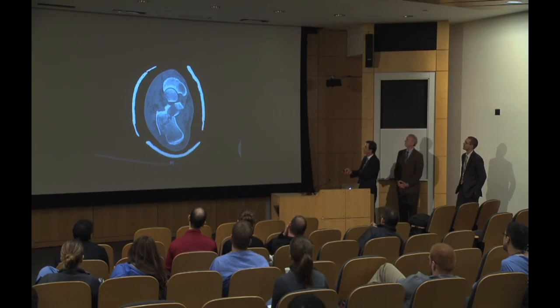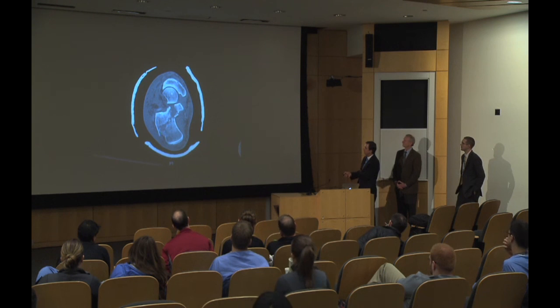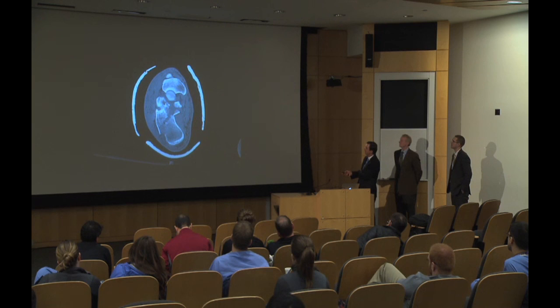To establish stability, remember we talked about the sustentacular fragment. This is what things have to anchor to, and essentially the posterior facet, although it's one large fragment, has been translated laterally, and it's very difficult to get this reestablished unless you can compress the posterior facet to the sustentacular fragment, which is why this anterior process needs to be brought in. You can see it here, I think. This needs to be brought in to the sustentaculum, and that will afford the space for the remainder of the posterior facet to be brought in. And that essentially is what the big deformity is in this realm here rather than the tuberosity.